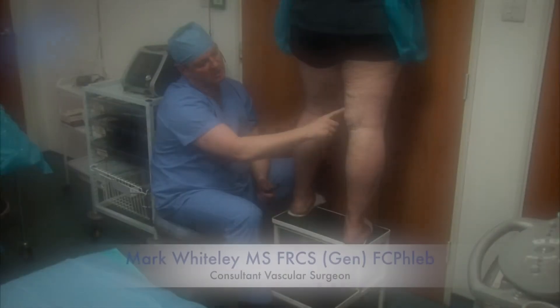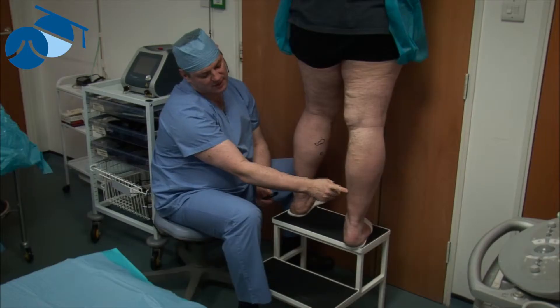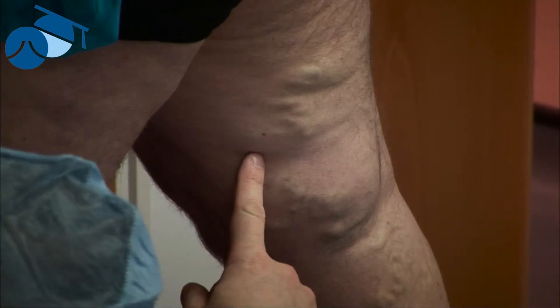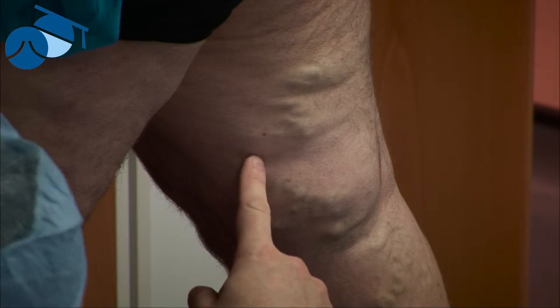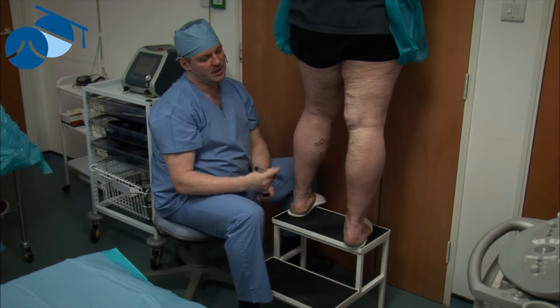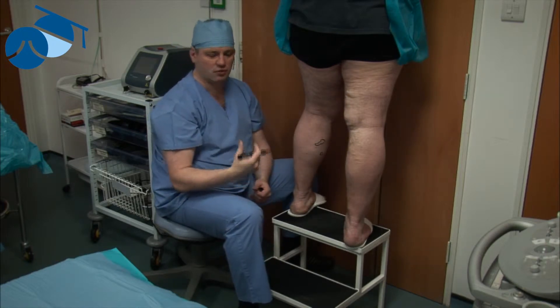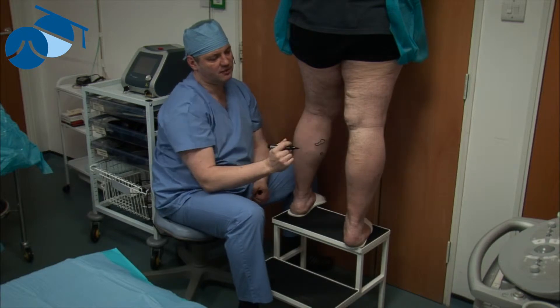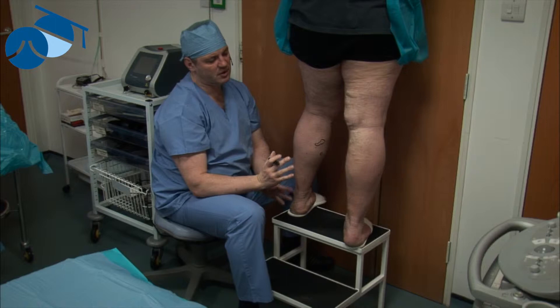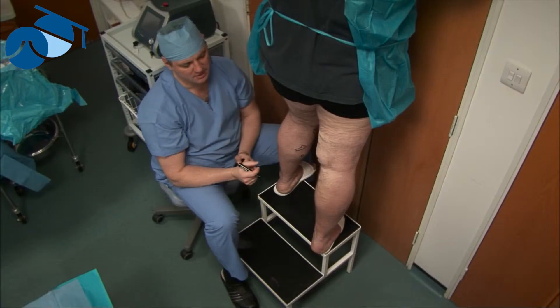Here we see some large varicosities, which are suitable for phlebectomy, coming down into the ankle. These are coming from the great saphenous vein, which is incompetent and will be treated with endovenous thermoablation. However, these varicosities are best treated by phlebectomy — they're far too large for foam sclerotherapy. TRIVEX could be used in some centers, but there are still concerns about cost-effectiveness for that.